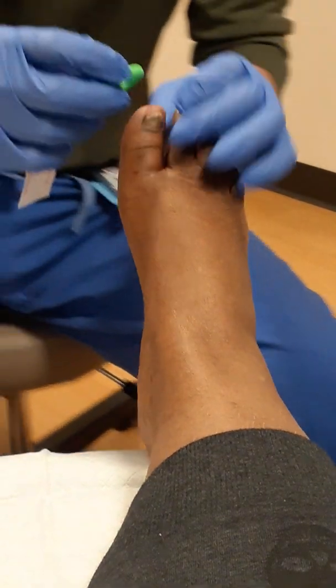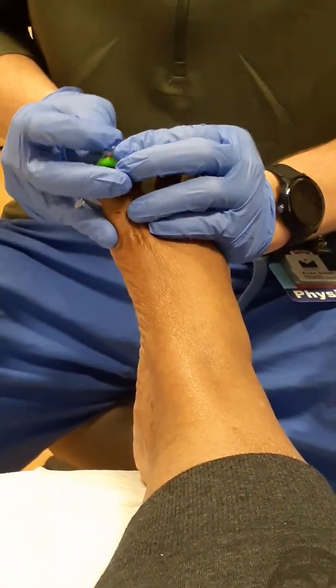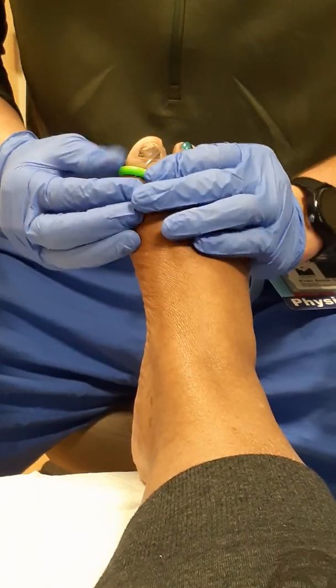This is just a little tourniquet to go over the toe, to help prevent excessive bleeding. Okay. Mm-hmm.